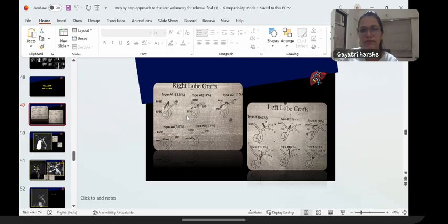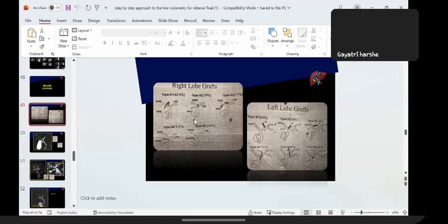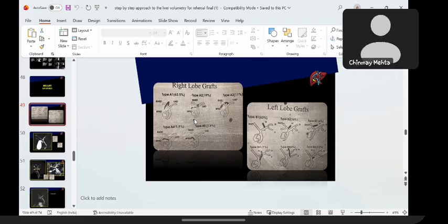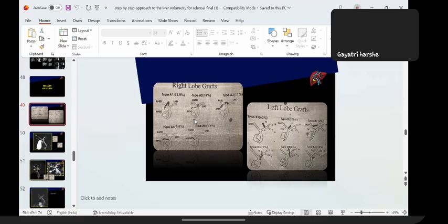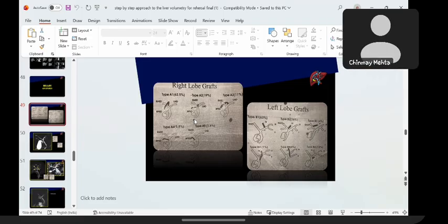Anything? Yeah, just the last question. This is a case scenario someone has posted. If segment 4 arises from the right, then can the right lobe be resected with two anastomoses of the right anterior and posterior ducts? So segment 4 is from the right hepatic vein, I think. Segment 4 artery, I have no clue. That's the question that they have put.